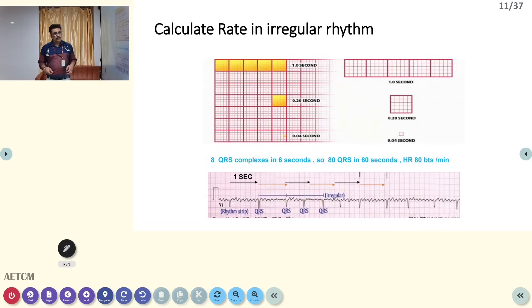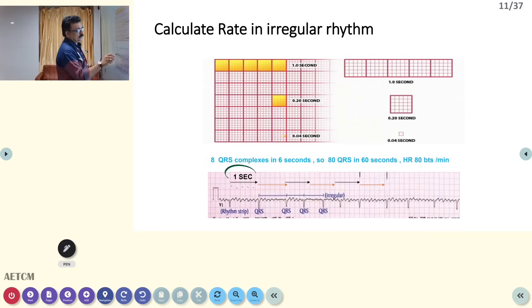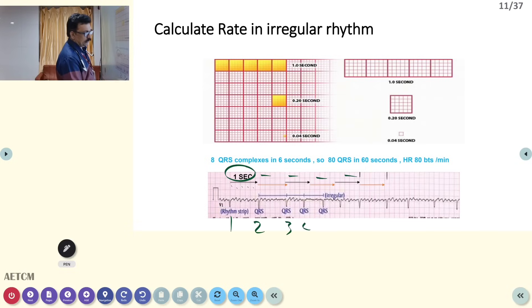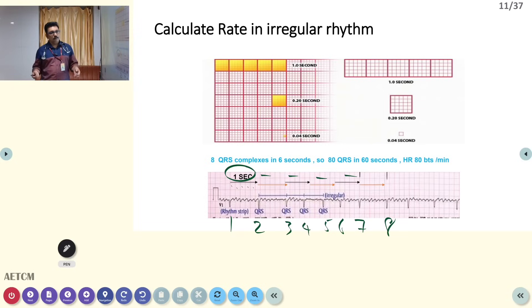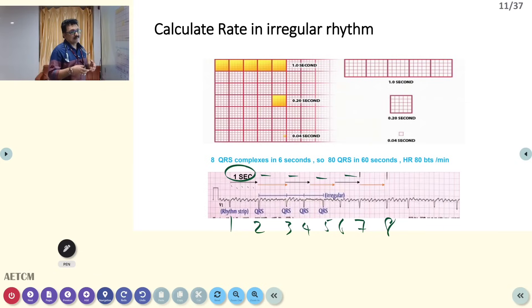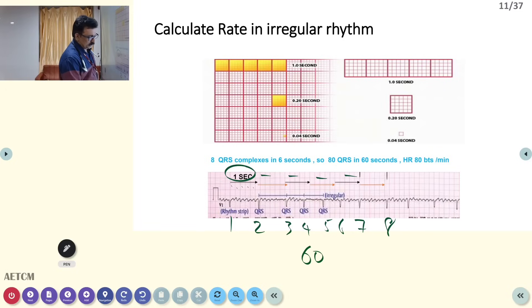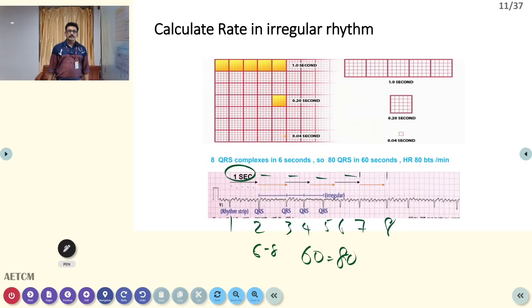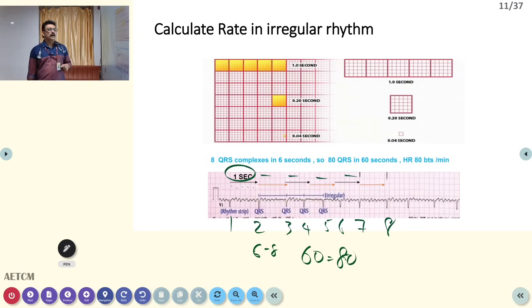For an irregular rhythm, count the number of large squares for 6 seconds (30 big squares), then count how many QRS complexes occur in that 6-second strip. For example, if 8 QRS complexes occur in 6 seconds, multiply by 10 to get 80 beats per minute. This ECG is of atrial fibrillation. Most modern ECGs print the rate and rhythm directly on the paper.